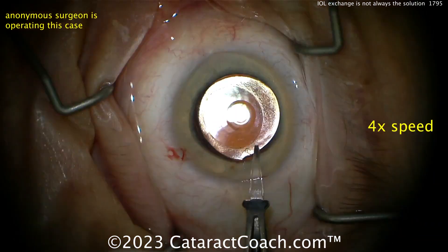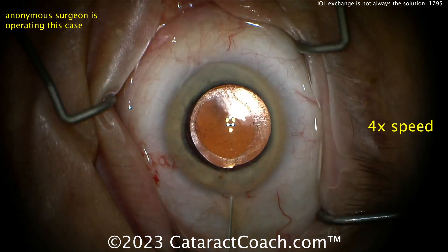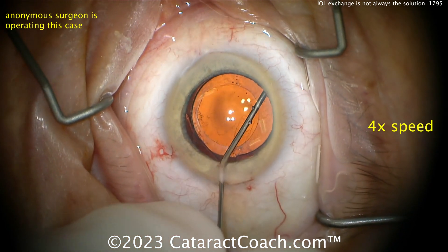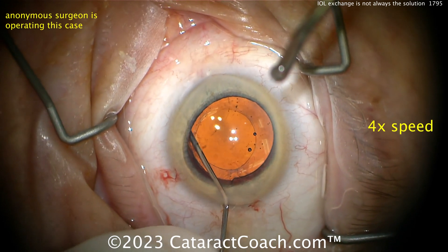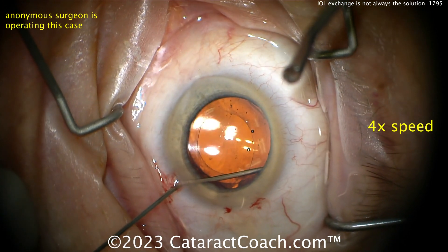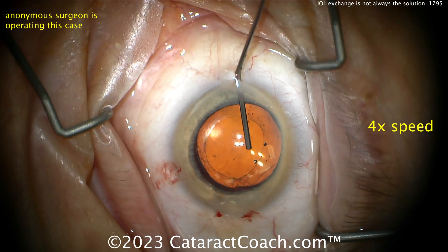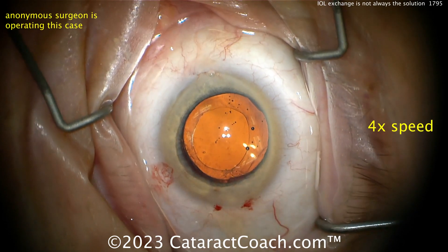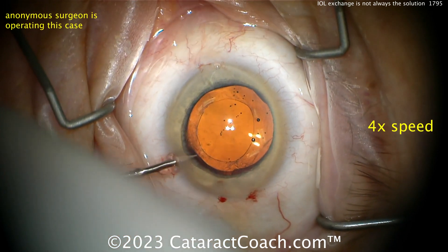So this patient is going to get this lens explanted and replaced with another lens. A wide phaco incision is made temporally. Using a needle to get under that rhexis edge, more viscoelastic — I like that. That visco dissection: get that dispersive viscoelastic behind the IOL optic, get a wave going across to help dissect it. We've sped the video up to 4x normal speed. The surgeon has a couple different pairs of relaxing incisions, which is going to help things out a lot.